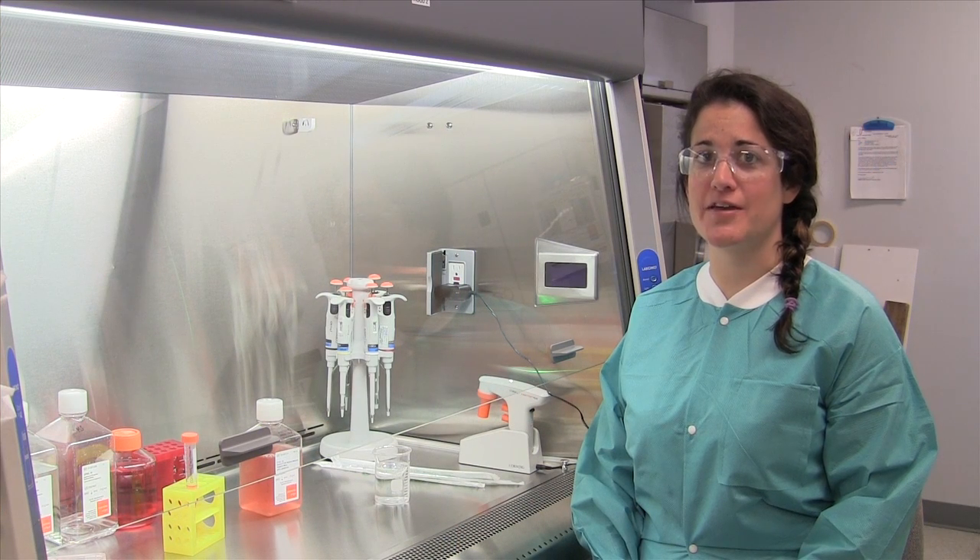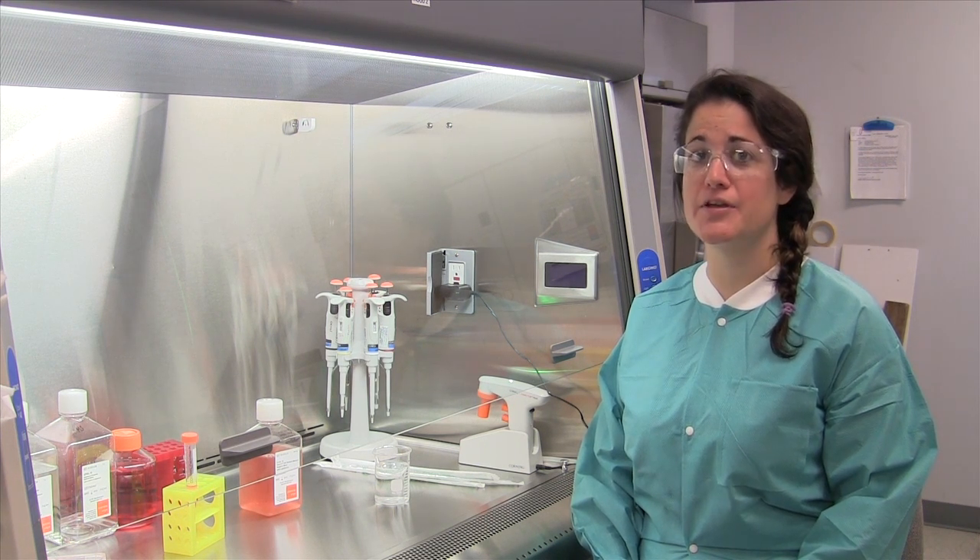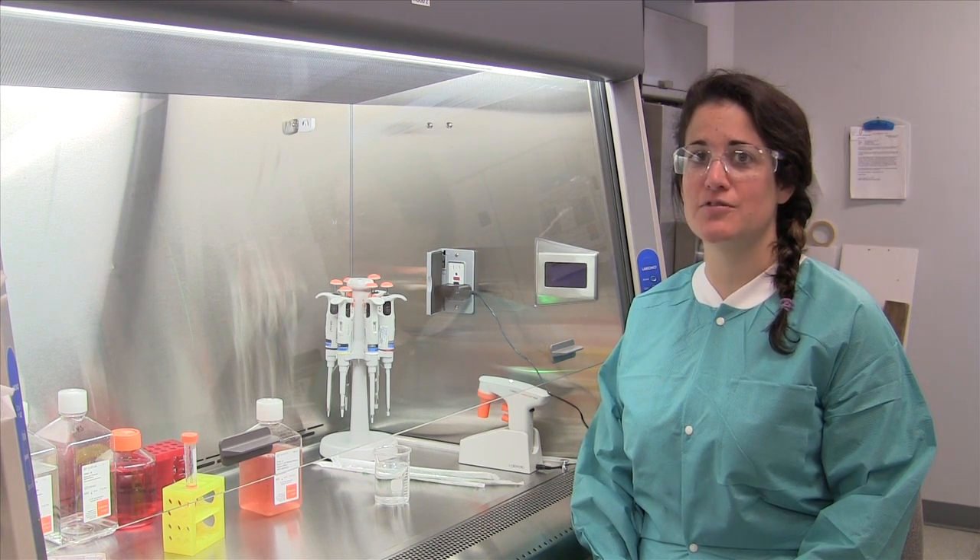Thawing out cells from cryopreservation can be a process that is often times overlooked and rushed. However, during this critical step, your cells need a little extra TLC. Here is a quick video tip to ensure happy and healthy cells.